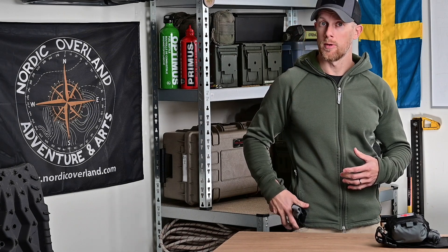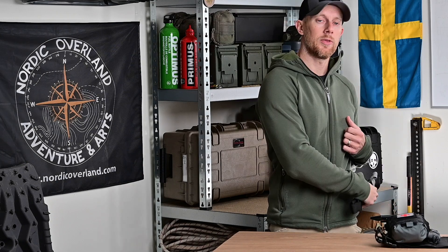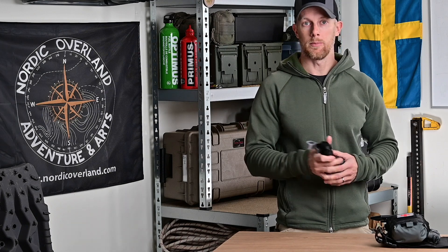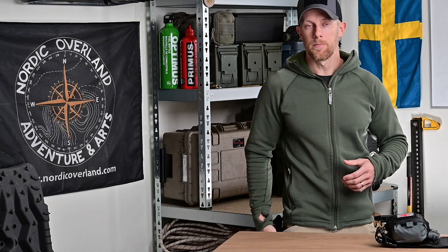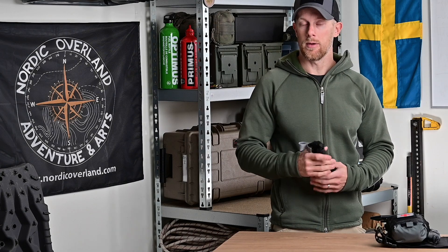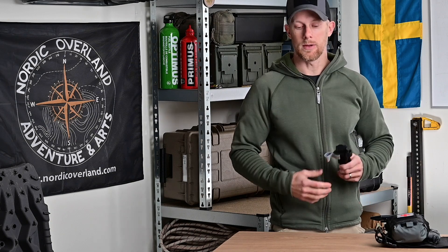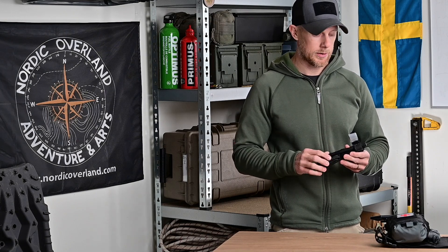Det här traumakittet sitter alltid på utsidan av mitt vänstra lår, och då vill jag ha en toniké som jag lätt kan komma åt med andra handen. Även om jag kan nå den tämligen enkelt med motsatt hand, vill jag ändå ha en toniké någon annanstans på kroppen där jag lättare kan komma åt den. Det innebär antingen en benficka på högerben, en jackficka eller i vissa fall en ärmficka.